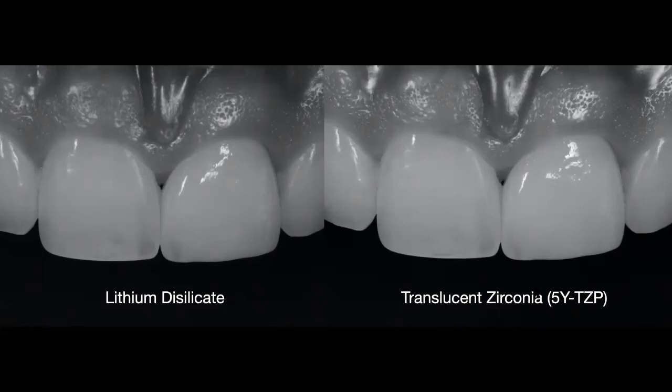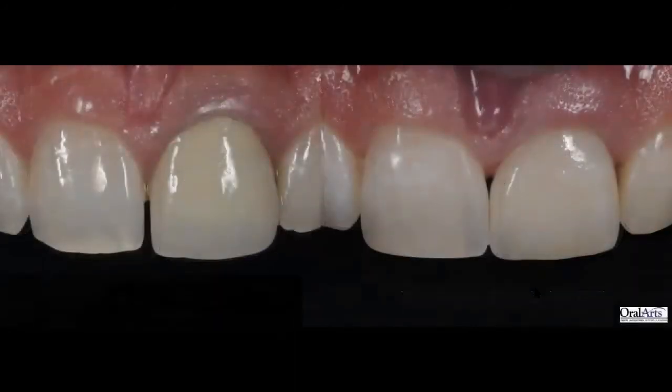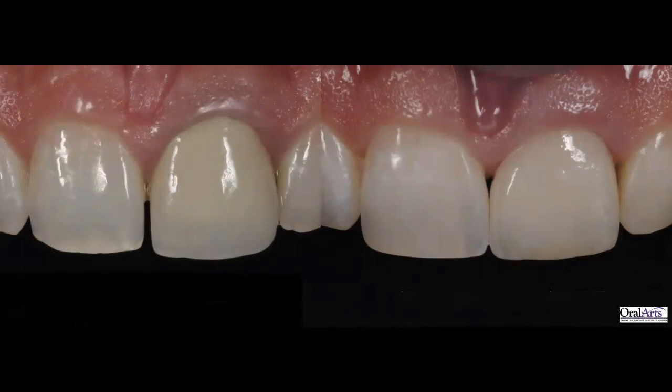So we chose with the patient because they were so alike, both restorations, and we did like more the value that we had achieved on that tooth, and the natural translucency that we were able to achieve, better light transmission. The tooth will appear to be less opaque in different lighting situations for the patient. The patient and I chose to use the lithium disilicate restoration, and that's what we finally cemented or bonded to that substrate.